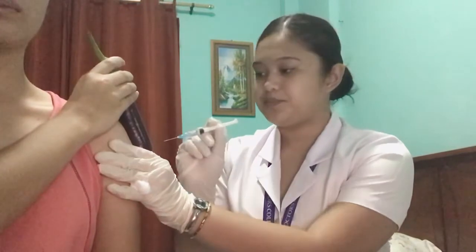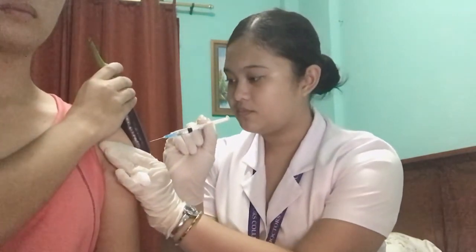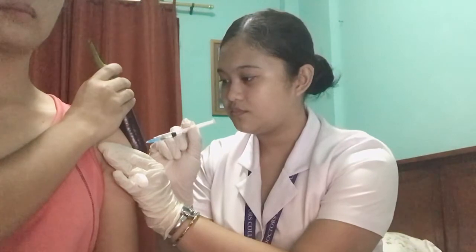So hold this position until you pull the needle. With the dominant hand, pierce the muscle at a 90 degree angle to the skin. Continuing, pull the skin taut with your non-dominant hand. Then aspirate the syringe by pulling back the plunger with your non-dominant hand.